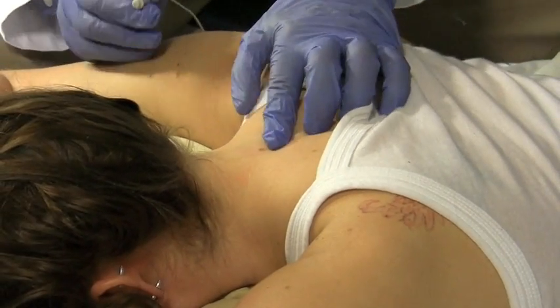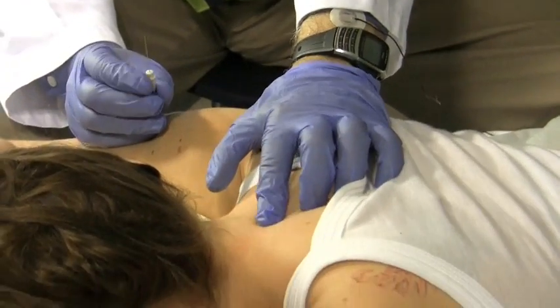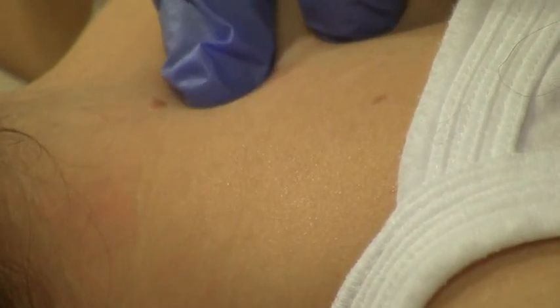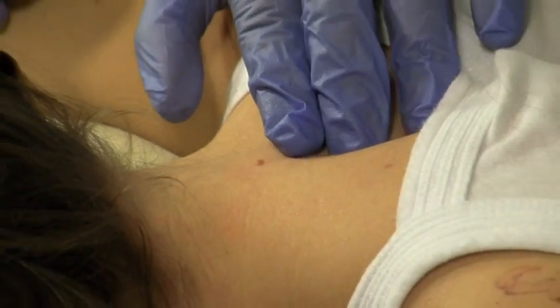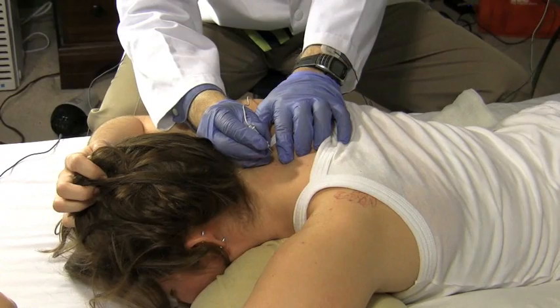I'm doing the left paraspinals. The way you localize those is look for the C7 spinous process — that's the most protruding bone up here in the neck. One level above that is C6, one level below that is C8, and then T1. So first I go to C7 because I want to make sure I get this one first.